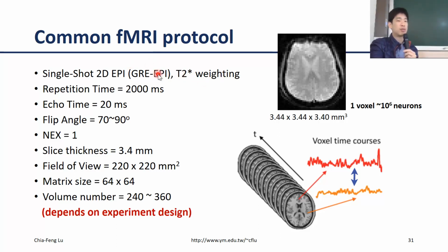So we use this because the hemodynamics, although slower compared to neuroactivity, actually involves pretty quick changes in your brain, because it only takes a few seconds, right? With the gradient echo EPI, we can image your brain in around 2 seconds, maybe less, maybe more.